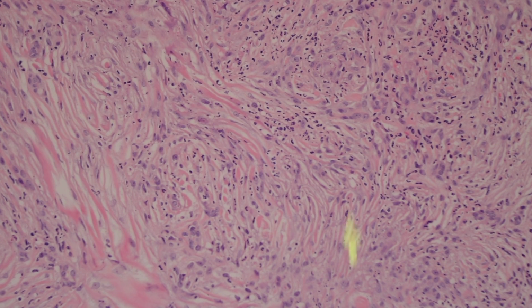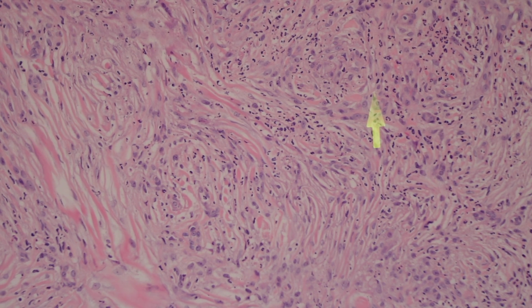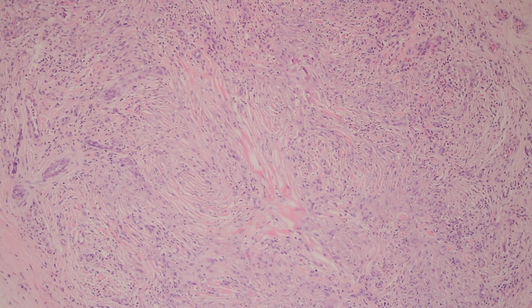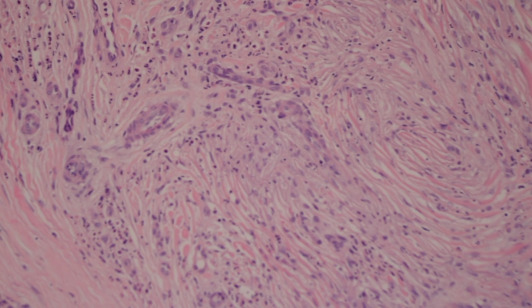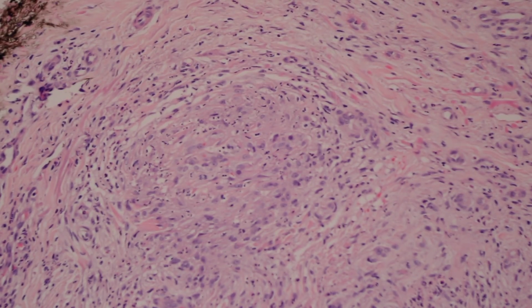And they're surrounded by layer after layer after layer of not fibrin, but actually collagen. This is collagen wrapping around and sclerosing around the vessels. There's proliferation of multiple small new vessels, and they're all getting trapped up in this collagen. And then there's also lots of neutrophils trapped in here. So this almost could have a wood grain pattern or a multi-layered onion skin pattern of fibrosis surrounding little tiny vessels. Here's a few more vessels that are standing out that have survived but are still wrapped densely in sclerotic collagen. And so this is great for erythema elevatum diutinum in the right clinical setting.